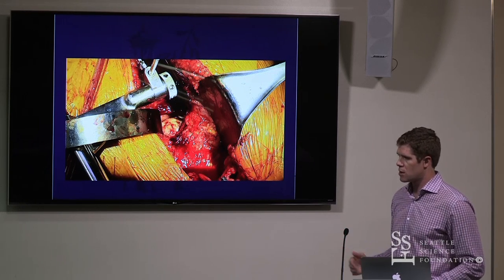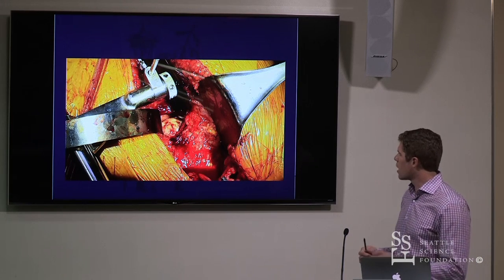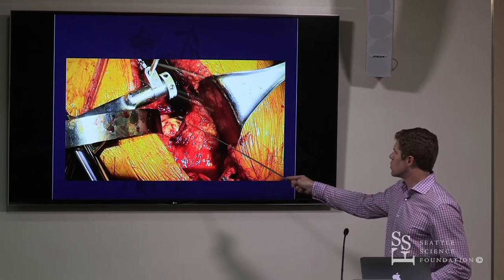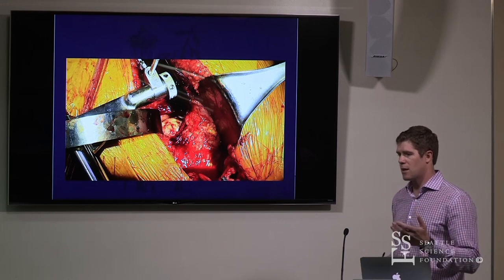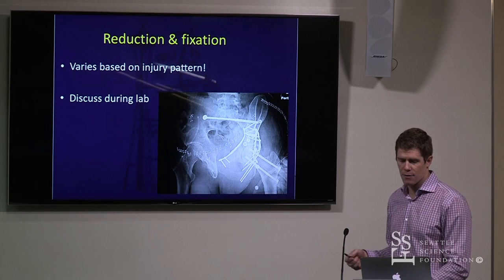The femoral distractor, the universal distractor, one pin is supraacetabular in the cranial portion of your incision, and the other goes directly into the trochanter, like Dr. Clavino's x-ray example. You can apply the distractor and get a very, very good visualization of the joint by doing so. And remember that you're really respecting the capsule and the labrum attached to that posterior wall fragment so that you're not devascularizing that fragment.